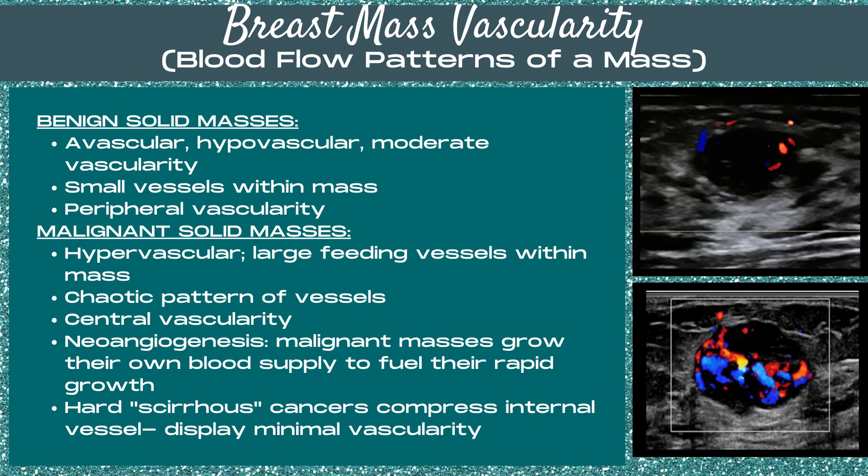This is based on the concept of neoangiogenesis, where malignant masses grow their own blood supply to fuel their rapid growth. Note that hard or scirrhous cancers compress these internal vessels and display minimal vascularity. Because vessels are so small in the breast, you can have a malignant mass that does not display hypervascularity.